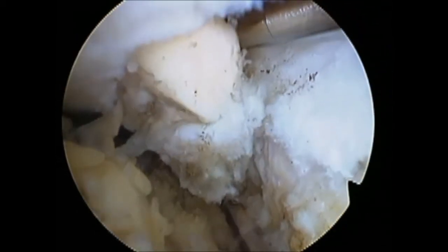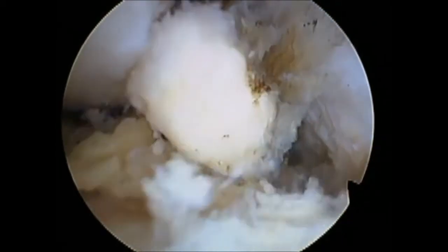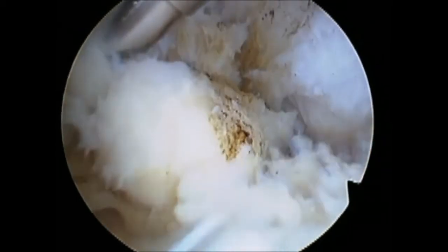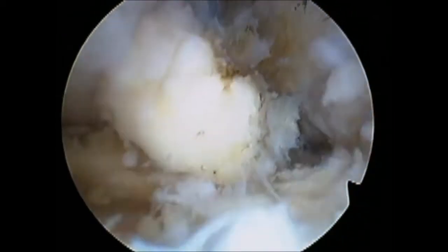It's important to have studied the pre-operative x-rays to determine whether this is a bipartite or tripartite patella. In the case of a tripartite patella, the second fragment can be removed using the same technique as the first.